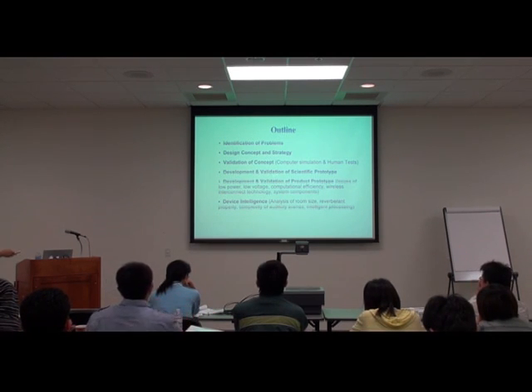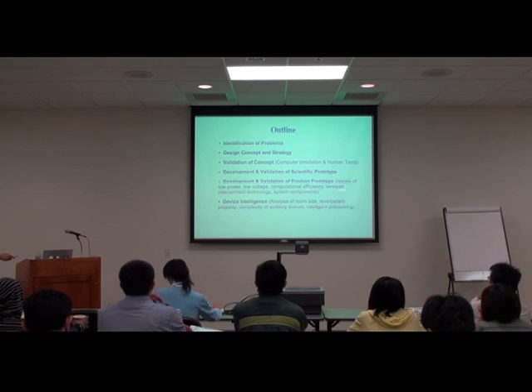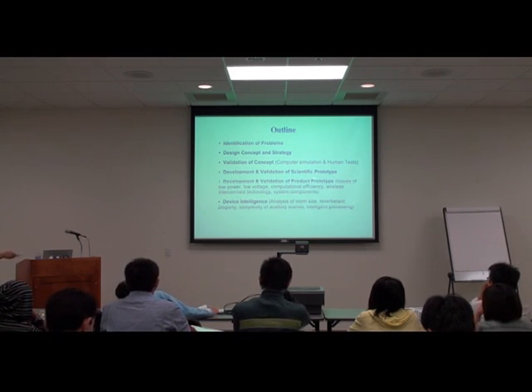And from that we evolve, then move on to consider the product prototype, and we have to address the issue of low power, low voltage, and computational efficiency, and then technology that is required to develop the real product.